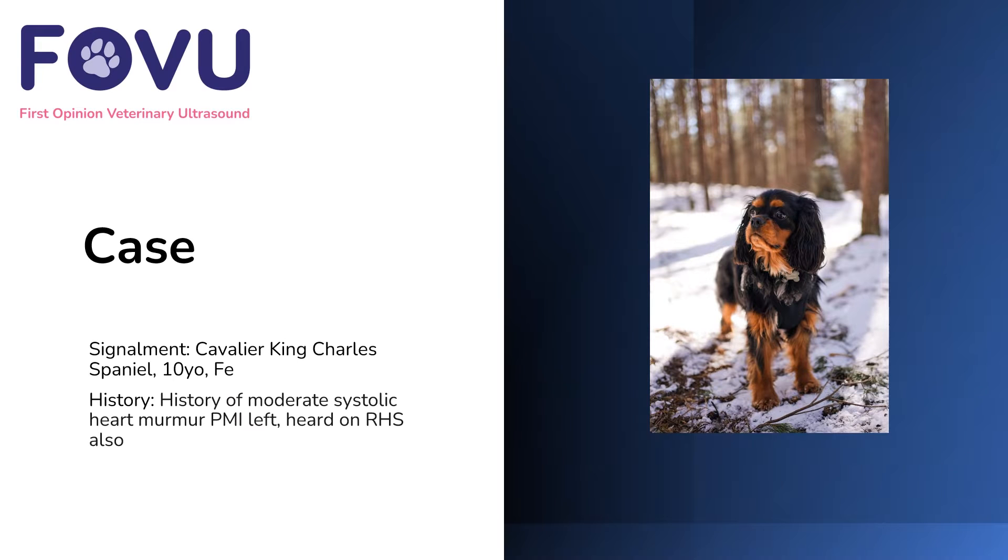Hello and welcome to this First Opinion Veterinary Ultrasound case. I'm Dr. Camilla Edwards. This was a King Charles Cavalier Spaniel who was 10 years old, female entire. She had a history of moderate systolic heart murmur with a point of maximum intensity on the left, and it was also audible on the right hand side.